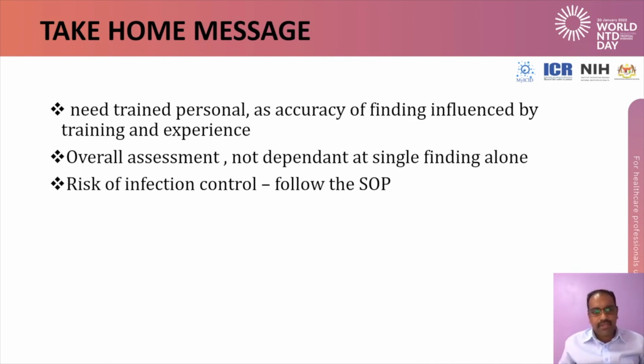My take-home message today is, we need trained personnel, as accuracy of findings is influenced by training and experience. That doesn't mean you just listen to this talk, take a probe, start scanning, put a measurement and start managing a patient based on the measurement. It may lead to a wrong pathway. You may need bedside, one-to-one teaching, and some experience of doing a few scans before you independently take on managing a patient based on your scan. And I think this point will be the most important point.